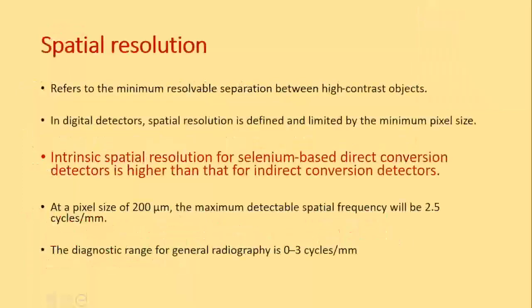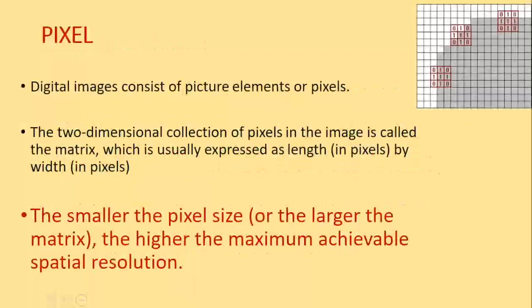So we've understood this concept. What you're looking at in a machine is, does it have small, tiny pixels? When you talk of 3D, you go to voxels too, but the more tiny the pixels are, the better for you. And the bigger the matrix, that's what you want.